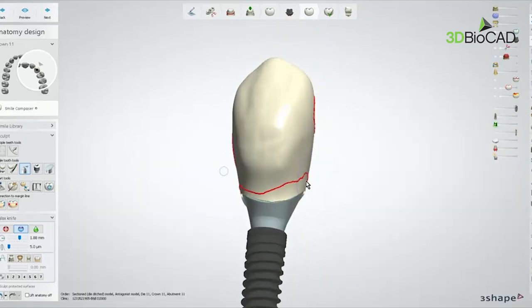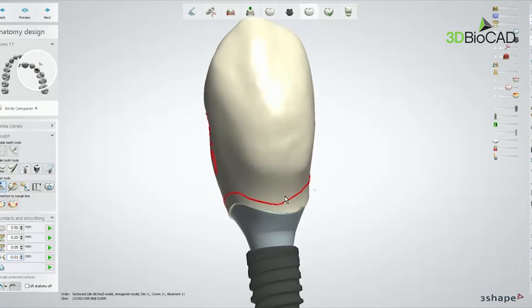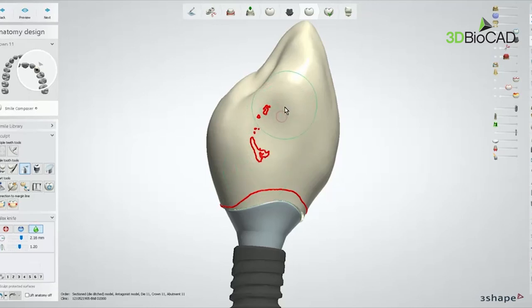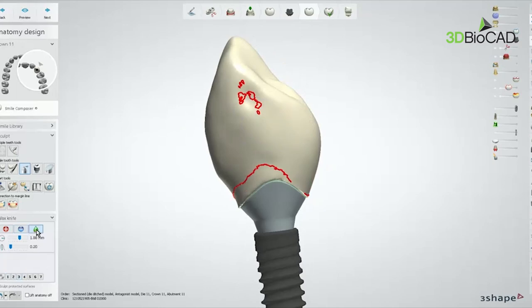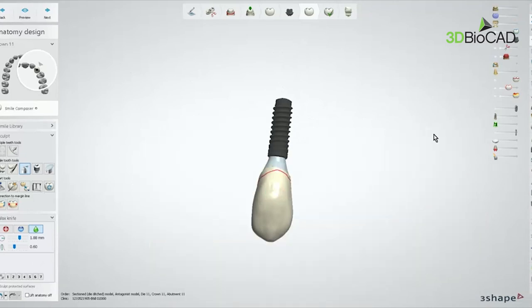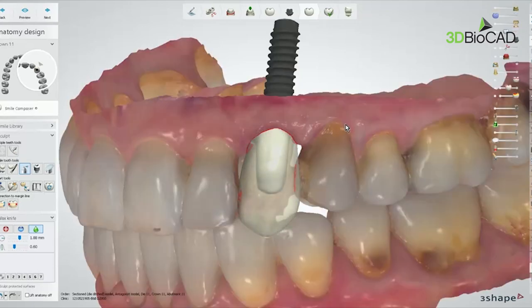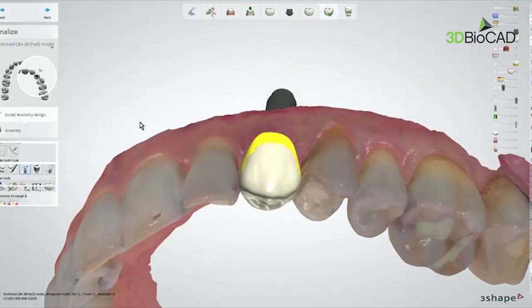Okay. Contact. When you have an implant case, using the contact cut, please use it a little bit carefully, because software can confuse the gum area as a contact too, and this time I'm not really happy with that. So after that, I'm just zooming out. Scan file if you want, of course, color. Without crown, abutment is there, crown's in here. Next, okay, next, I just click next.